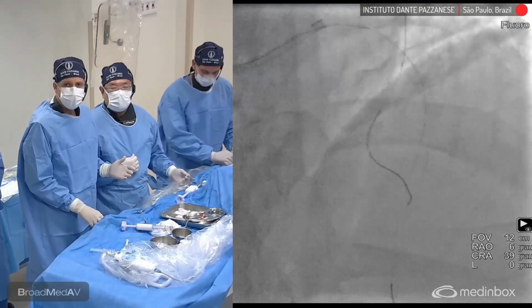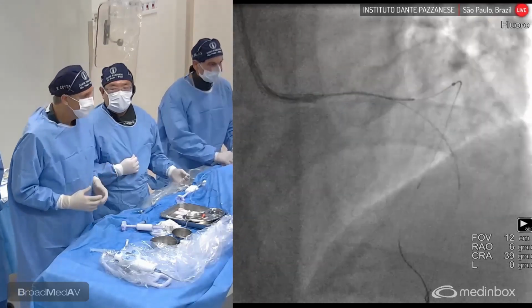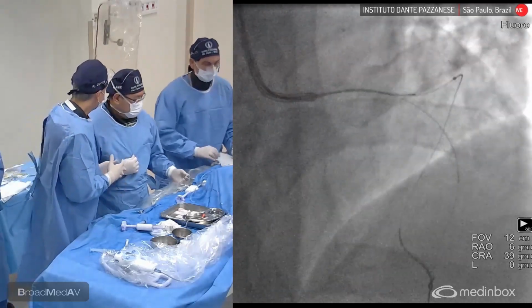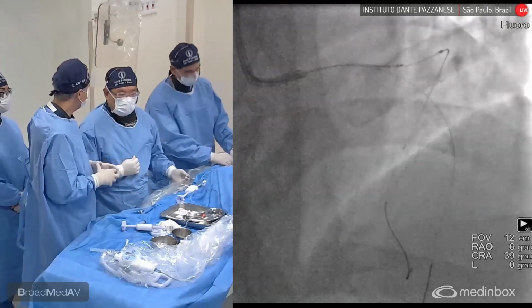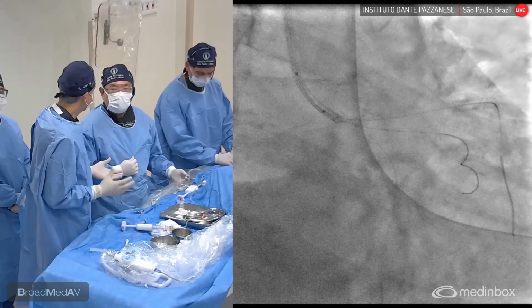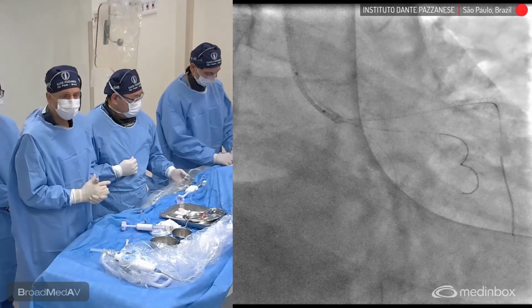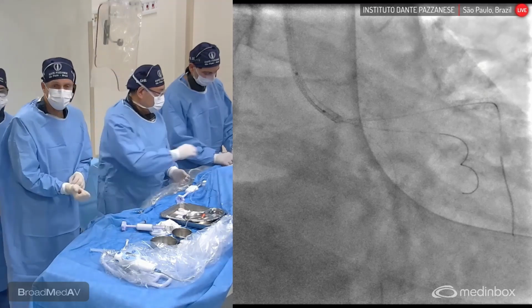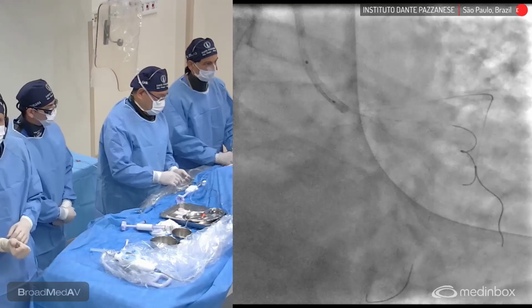And this is the final result. I see you have done IVUS. What's important here, Louis, is to do IVUS when you have this type of anatomy, bifurcation, to see the full extension involving the left main, with different diameters. It is always important to have more information. Can I have the IVUS on screen? We're going to see what we have learned by IVUS here.